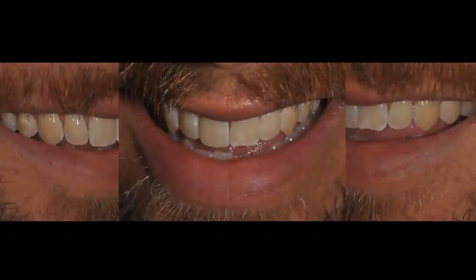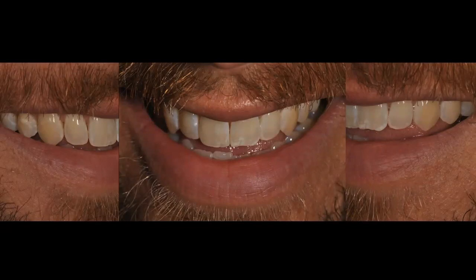Now, on a case like this, something may be different. I have learned over time that when I have patients with very saturated teeth, like the ones you're seeing right now, you can see the canines, a very dark yellow, kind of brownish shade. You can see the centrals and the laterals. So we can all appreciate that there's a lot of saturation on these teeth. And what I've noticed over time is that teeth that are very saturated, for some reason, are not very prone to hypersensitivity. So in these patients, when I use higher concentrations, I don't see that they really have hypersensitivity.